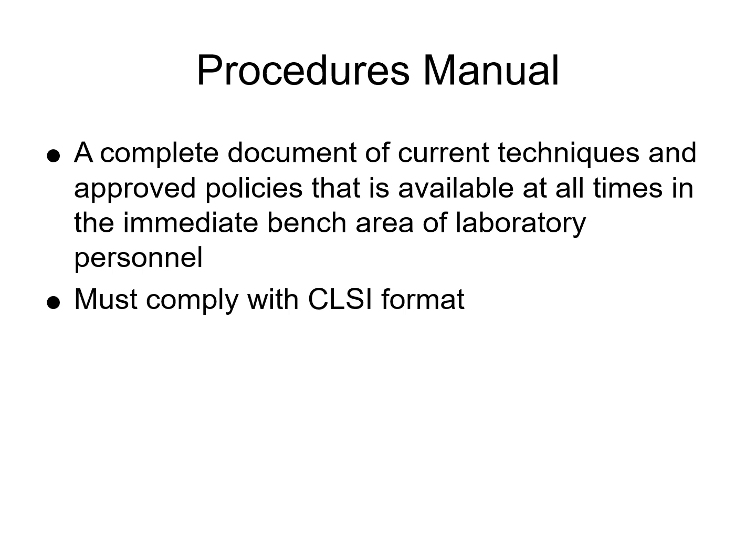The importance of this is it has a safety component to it. It reduces laboratory accidents and exposure risk. Accuracy helps to ensure test results are consistent and reliable. Also helps with efficiency, so laboratory personnel can perform tests without delay. Also helps with regulatory compliance, so it meets external audit and accreditation requirements.